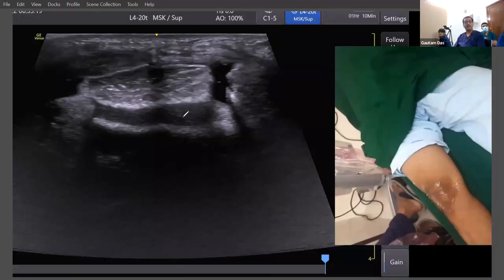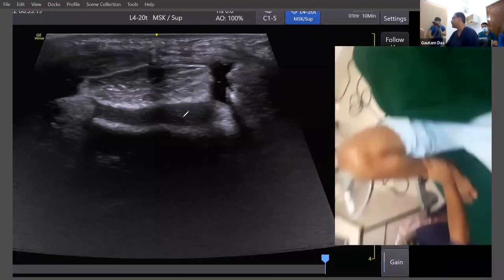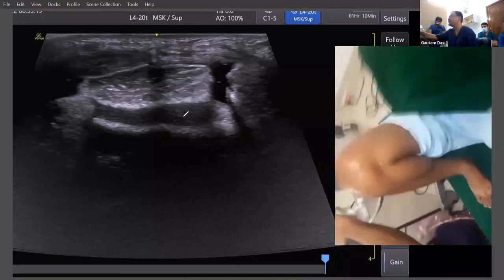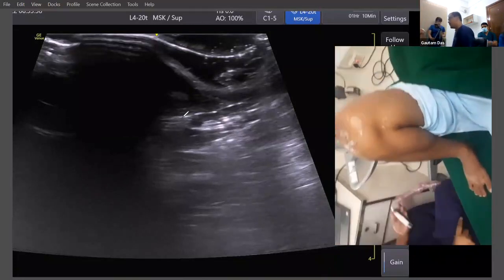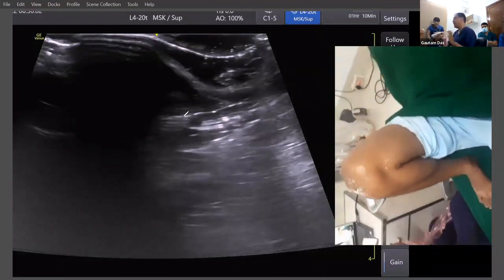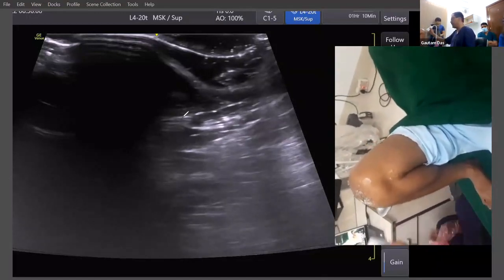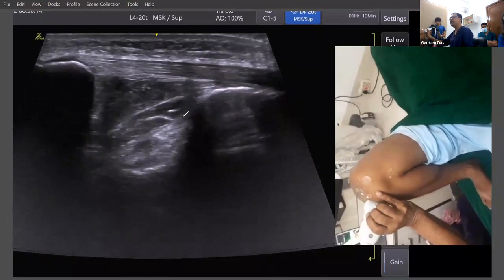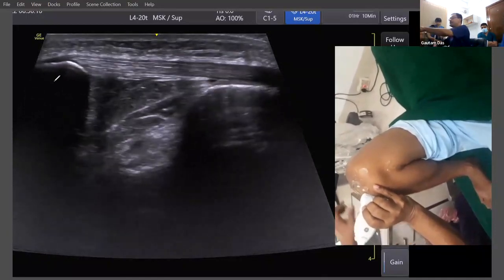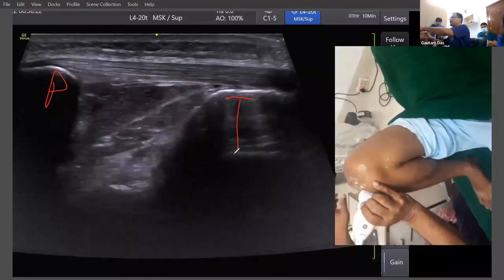The ACL has two parts: an anteromedial part and a posterolateral part. To visualize it, we need to flex the knee maximally. I'll be flexing it maximally and searching for the intermeniscal transverse ligament — the ACL will be just below that. One end of the probe will be on the patella on the midline, and another part toward the joint. Let me reduce the depth a little bit so you can appreciate it nicely.